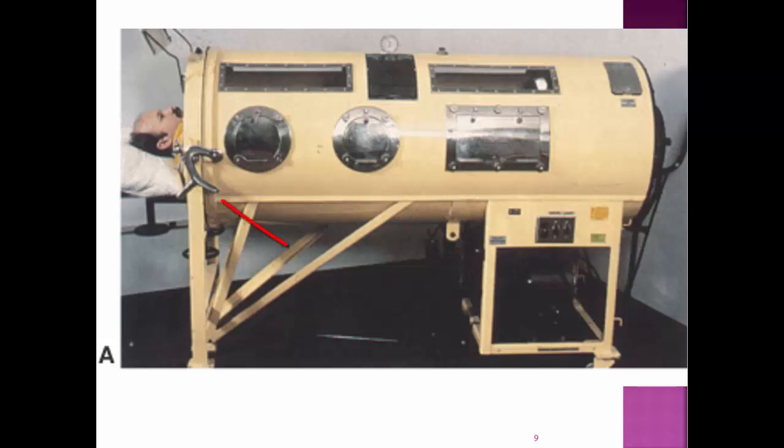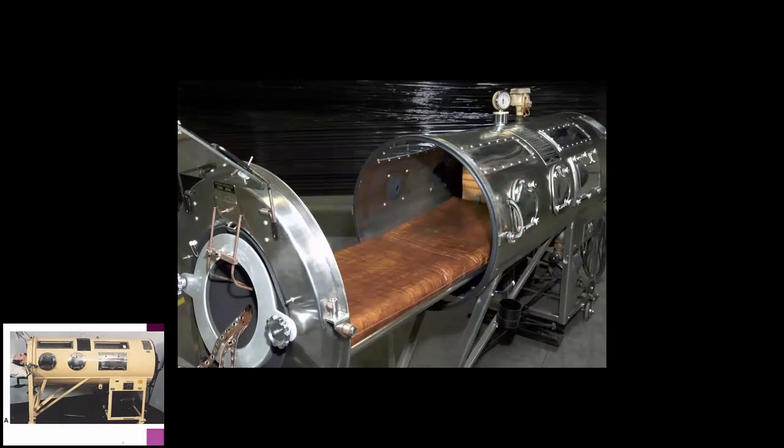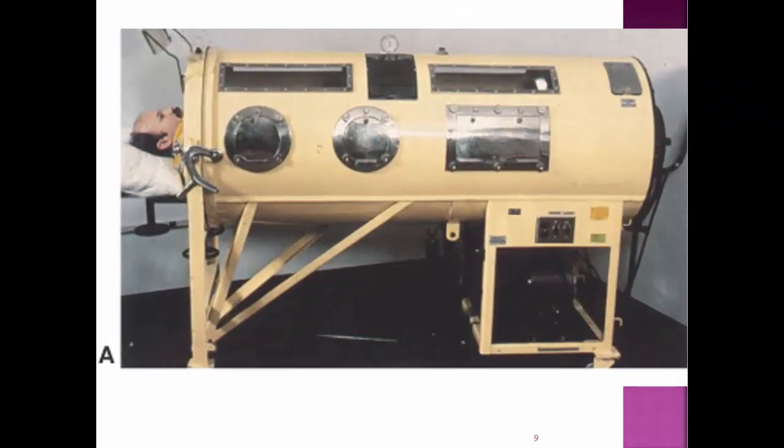But you can see the patient over here and the viewing panels for looking inside, and then the access panels. Depending on how your patient tolerates it, you can actually take the patient out of the iron lung. If you can't take them out, then you have to use the access panels for patient care, for IV and cleaning them up, Foley management. The business end is down here on the other end.